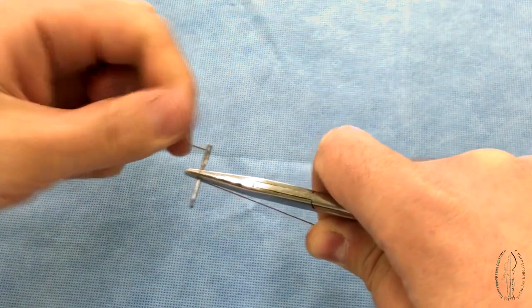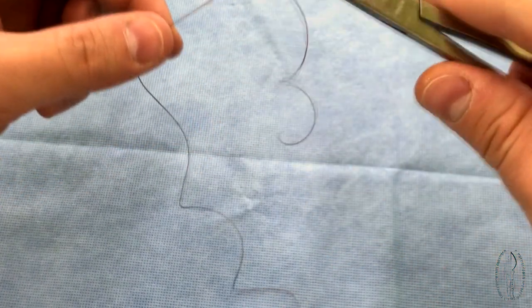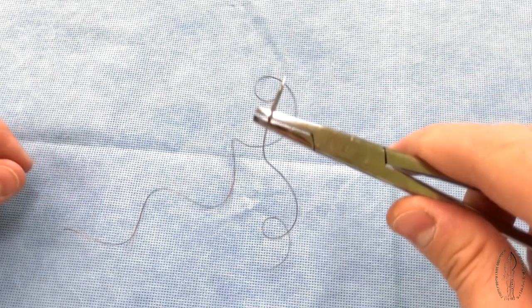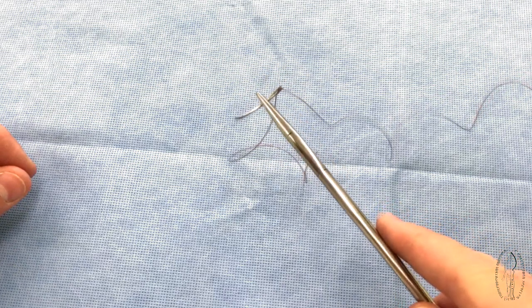One third of the filament should be shorter, two thirds longer. This proportion is made by pulling its ends and is necessary for the same length of the filament on both sides of the wound when a simple interrupted suture is applied.